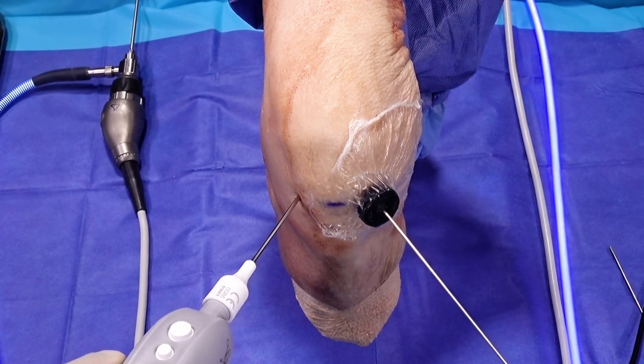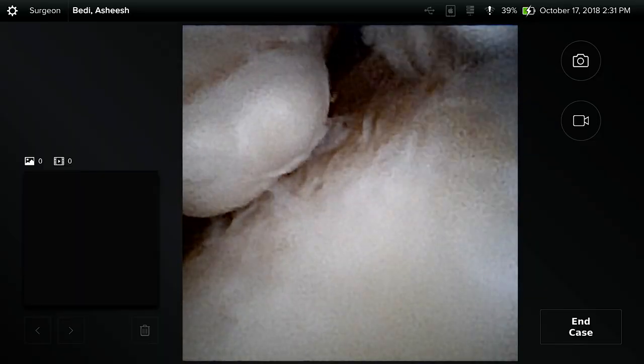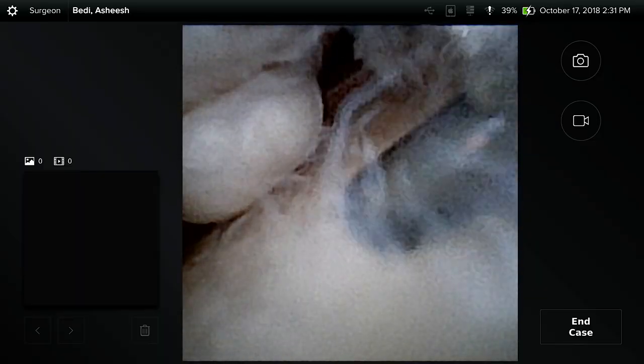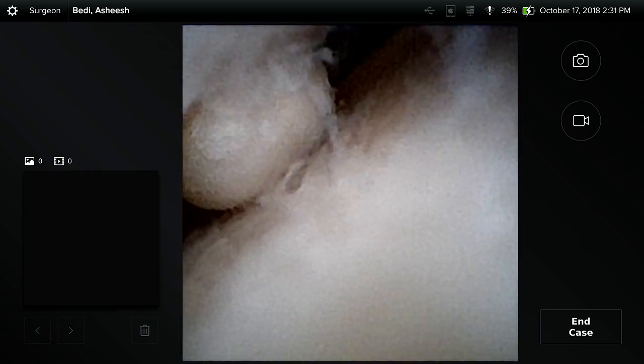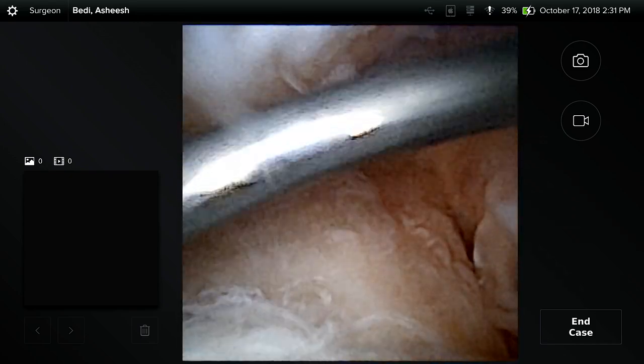Now we'll use this probe, which can nicely be inserted through the cannula. There's a loose body there — we can probe it, and with our nitinol probe we can hook that loose body. Here we can instrument the lateral compartment and see this lateral meniscus. Importantly, we're seeing all of these structures without any assistant applying any varus to the knee joint, and I'm able to drive right to the posterolateral portion of the knee towards the popliteal hiatus.